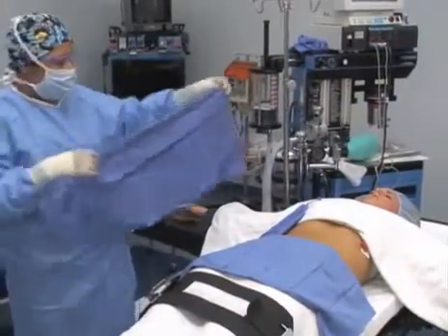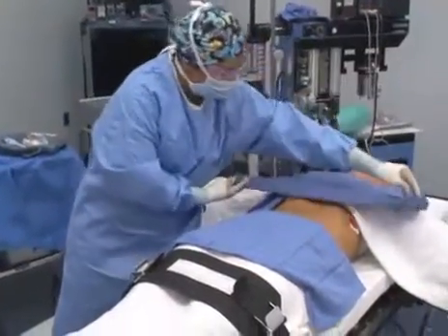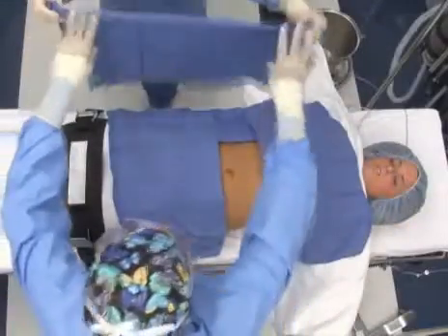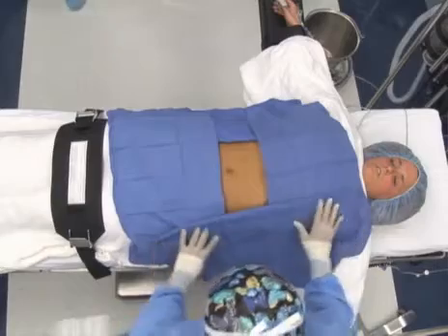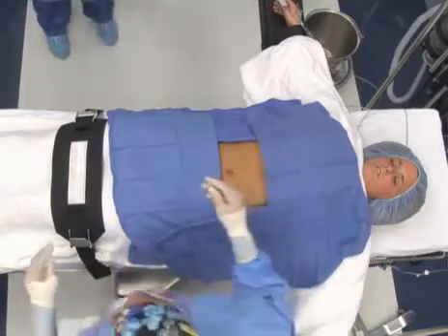The open area inside the frame is called the fenestration. The fenestration can be square, oblong, or oval if a disposable fenestrated drape is used. The plastic incise drape is commonly placed over the entire surgical site on top of the towels and any bottom sheets and towels which form the fenestration or opening for the incision.